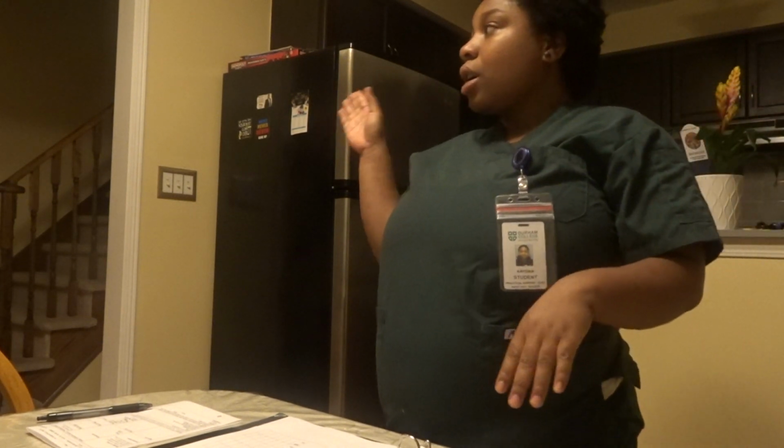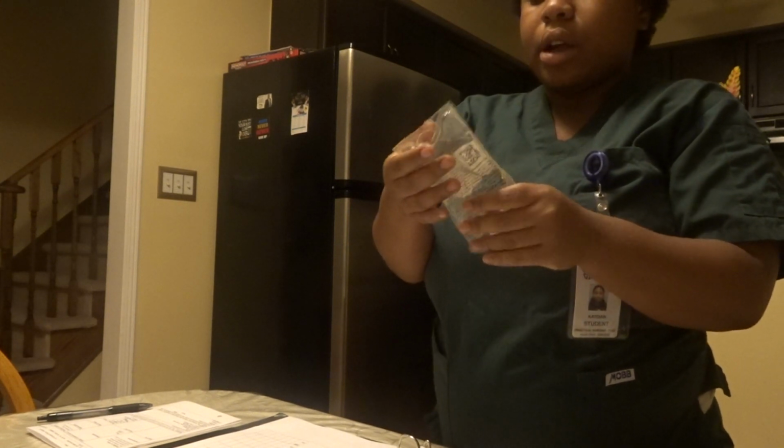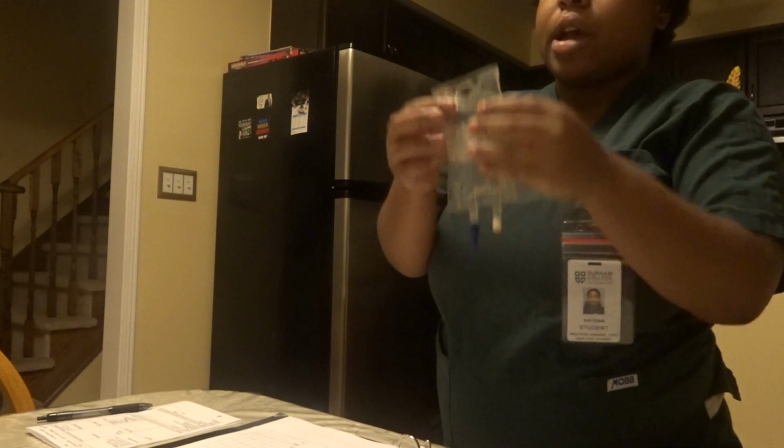Okay, so now after going to check my main line to make sure everything is okay, I'm going to wash my hands. Then I'm going to select the correct medication. And then before I go on to my first check, I'm just going to examine the bag, make sure there's no leakage, and make sure its clarity, there's no cloudiness in the bag.